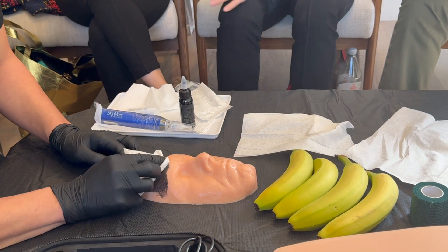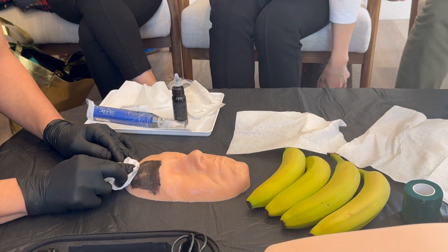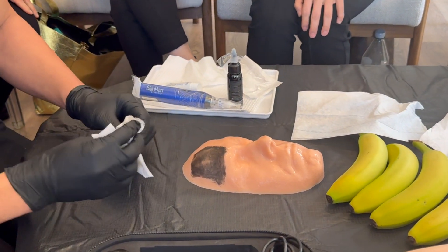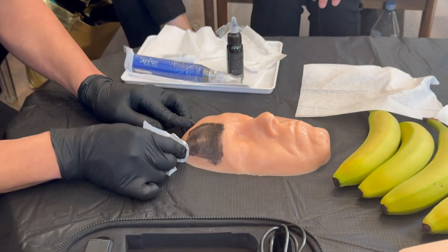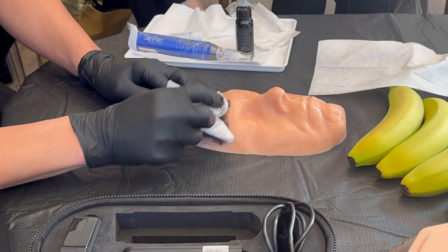It's looking pretty good, Carlos. Looks like we're getting some good transepidermal delivery. We're painting now. And then makeup remover after this? Yeah, get the makeup remover there.